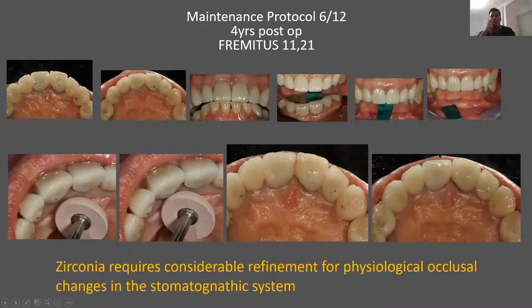And Sarkis, did you realize the lower anteriors would wear further with this type of hard restoration, or did you see that over time? I've seen this over time and I've stopped doing zirconia restorations 95% of the time. Now my technician Harry is here present at the moment and he knows how the practice has changed. So for the last 6 years I've basically been using metal ceramic. You can see later on other patients, it's purely gold backing and I get just as good aesthetics and probably a very, very good fit of the crown that will surpass any kind of zirconia restoration.